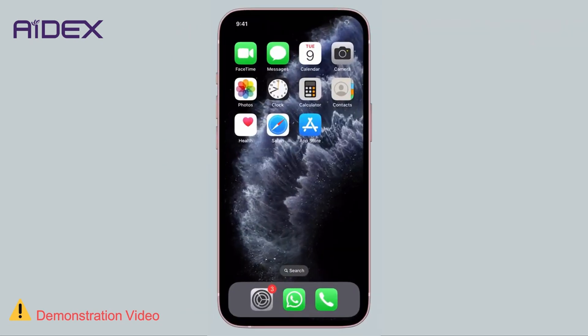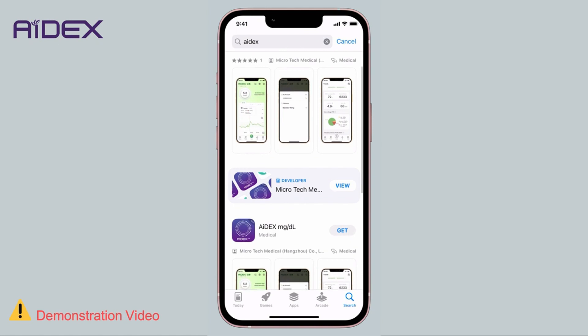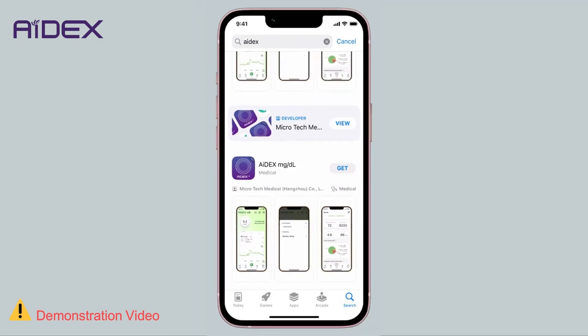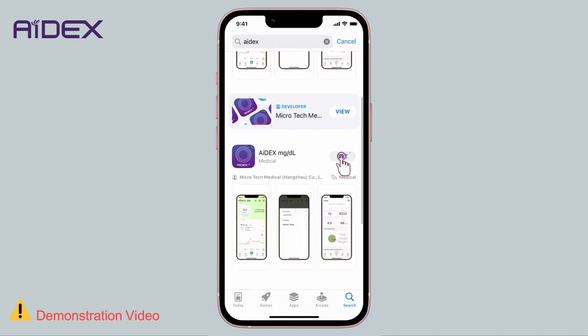Step 1: Search in the App Store using the term 'AiDEX mg/dL'. This is the application version compatible with the glucose monitoring unit used in most Arabic-speaking countries. The application is also available in millimoles per liter, which is used in countries like the United Kingdom, Canada, and others. Choose 'AiDEX mg/dL'.